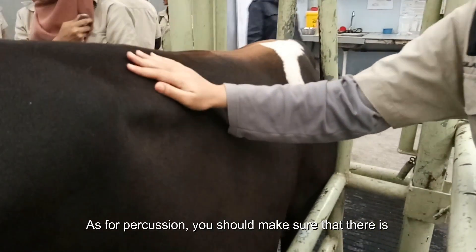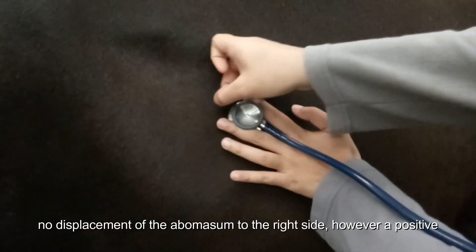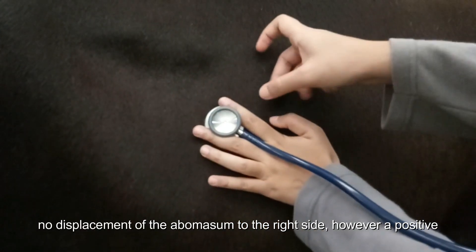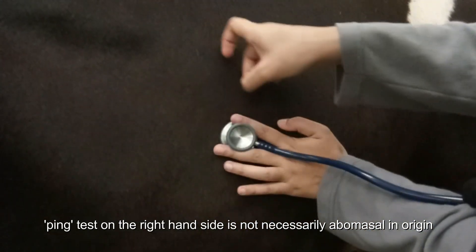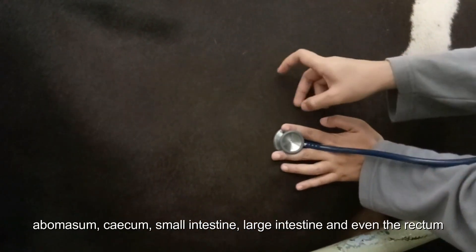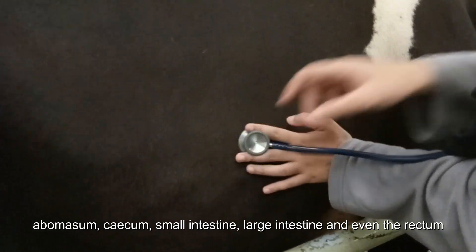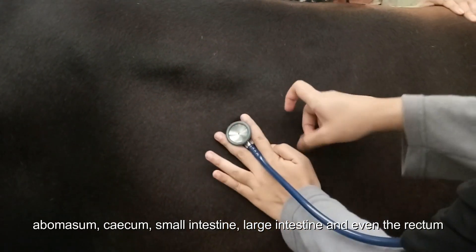As for percussion, you should make sure that there is no displacement of the abomasum to the right side. However, a positive ping test on the right hand side is not necessarily abomasal in origin. A right-sided ping can originate from the abomasum, cecum, small intestine, large intestine and even the rectum.